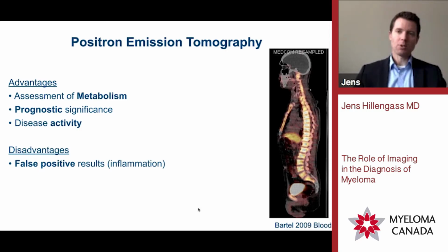There are developments to be more specific for myeloma, but this is at the moment rather research. It's not in the clinical routine yet, but we are developing better tracers to differentiate between inflammation and malignant infiltrations or myeloma infiltration. It's rather costly, but that's a problem, hopefully, that politicians should deal with. Sometimes not, but yeah, they should.